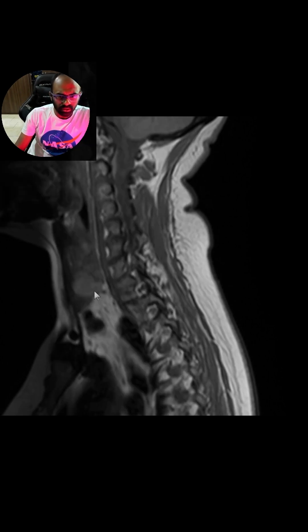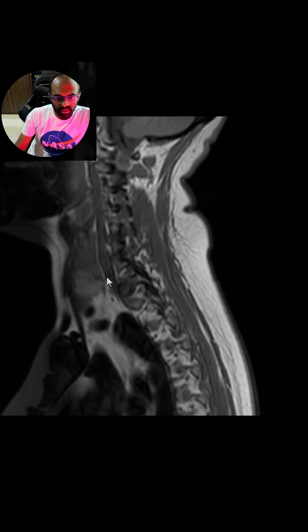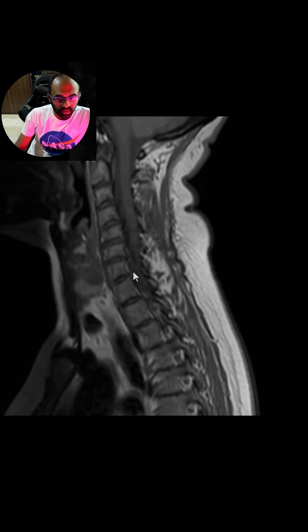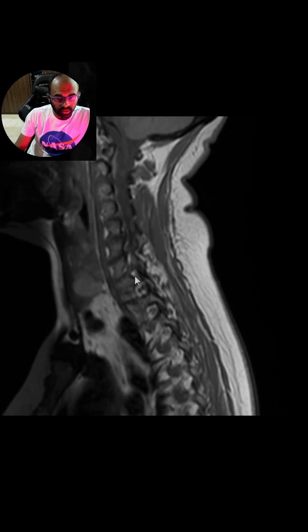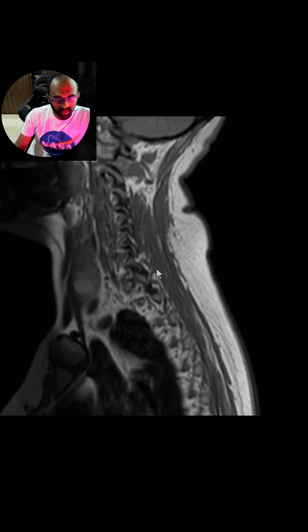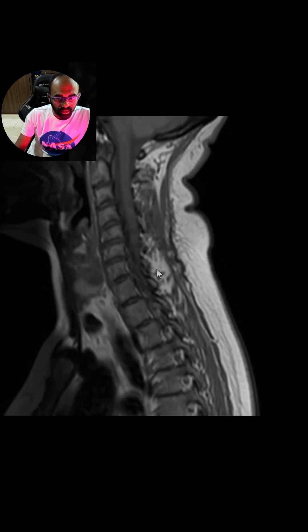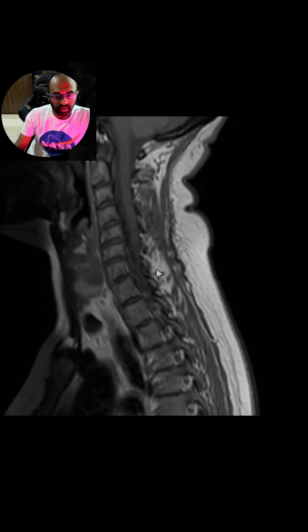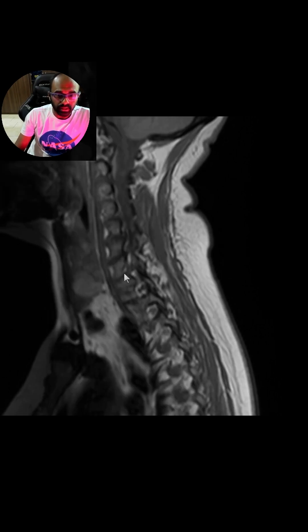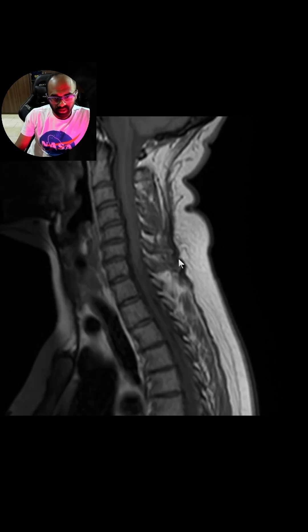Quite often there are nodules in the thyroid, and it's very difficult to comment on the nature of these nodules on cross-sectional imaging. Always recommend an ultrasound for detailed evaluation, grading them based on the TIRADS system and managing appropriately.